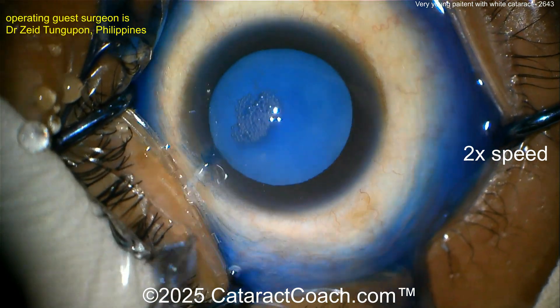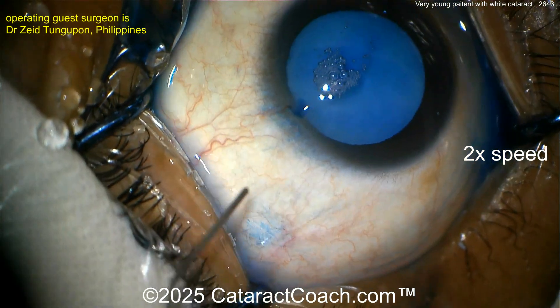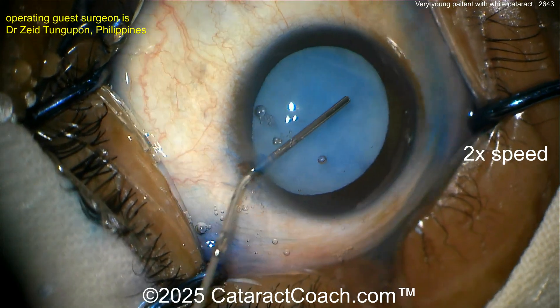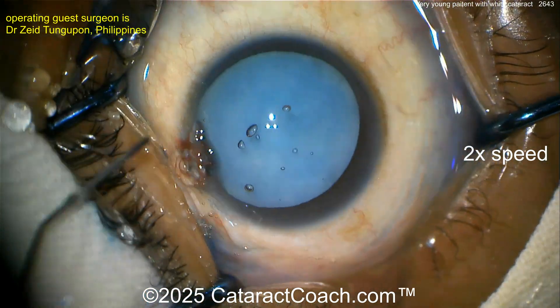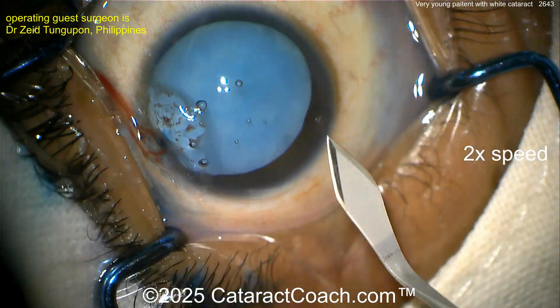So prior to putting the blue dye in, the lens nucleus was so white it was whitish-bluish without trypan. And so this means that when you puncture this, it's going to be intumescent for sure and there's going to be no nucleosclerosis. You don't need a phaco probe in this eye — you just need the I/A probe.